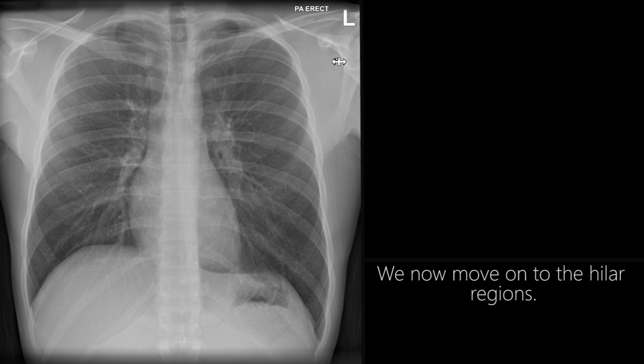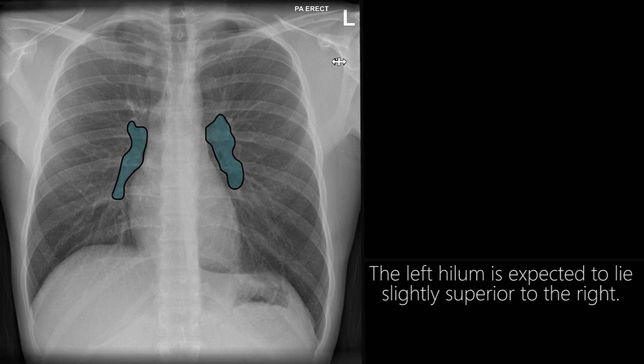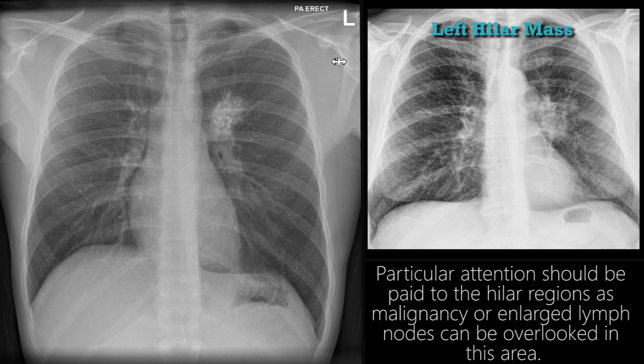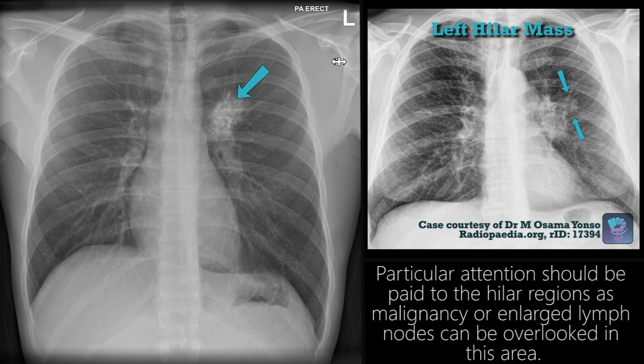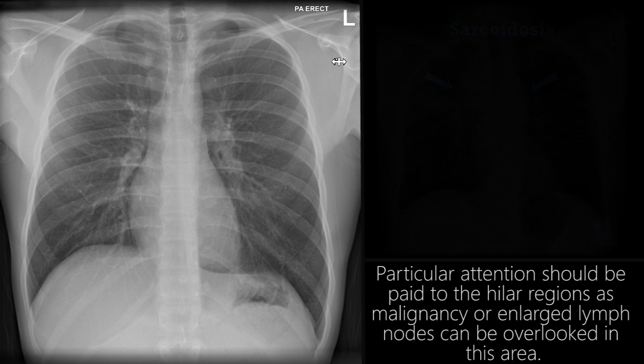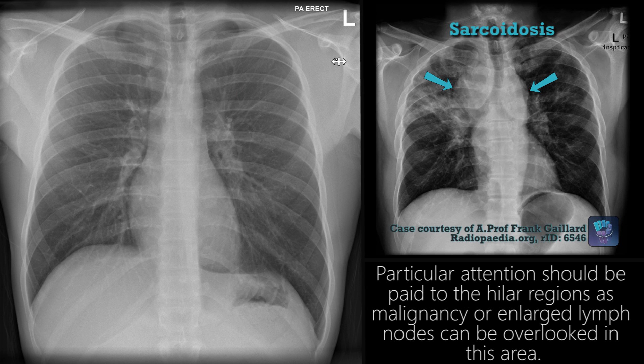We now move on to the hilar regions. The left hilum is expected to lie slightly superior to the right. Particular attention should be paid to the hilar regions, as malignancy or enlarged lymph nodes can be overlooked in this area.